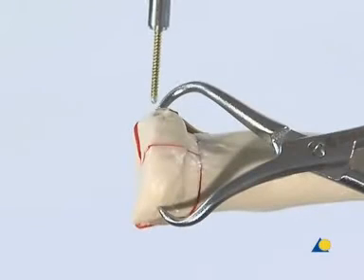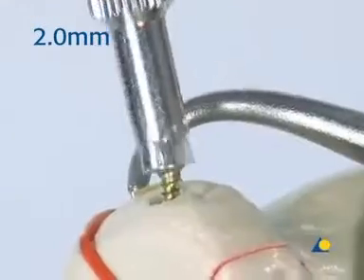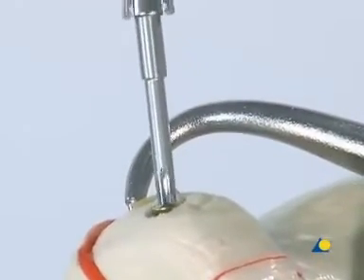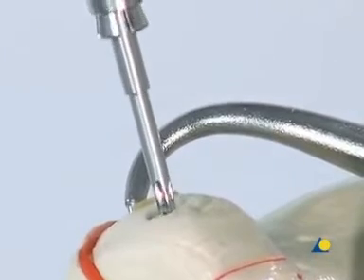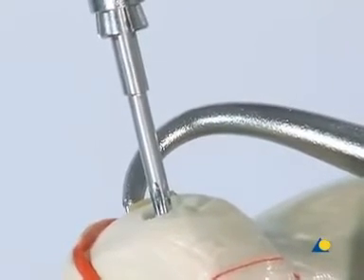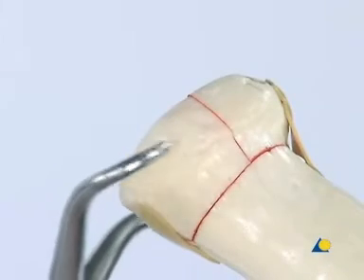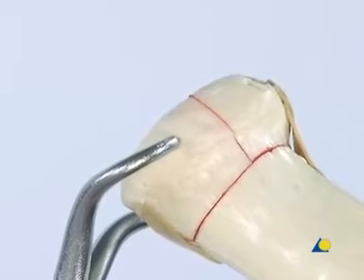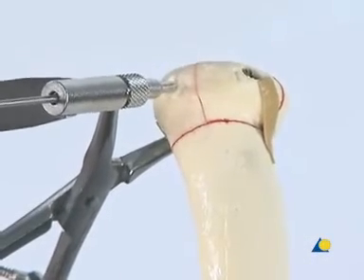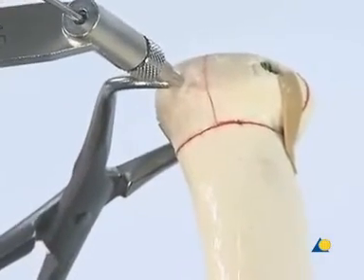The star drive screwdriver is used to insert the 2 mm cortex lag screw, which compresses the two fragments. The screw head can be seen to lie below the subchondral surface. The forceps is removed and placed across the remaining intra-articular fracture. The next step is to insert a second lag screw, which will provide compression between the third fragment and the first two.